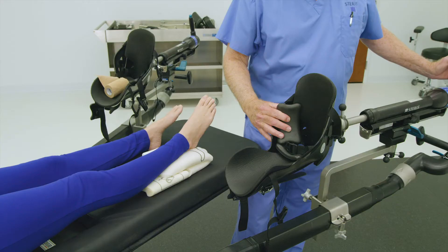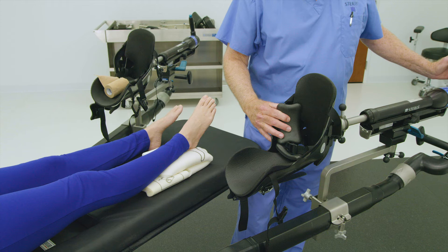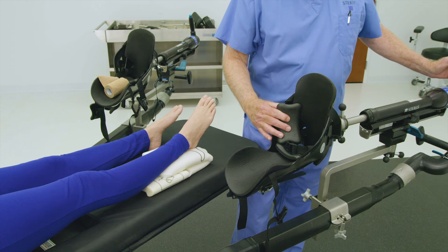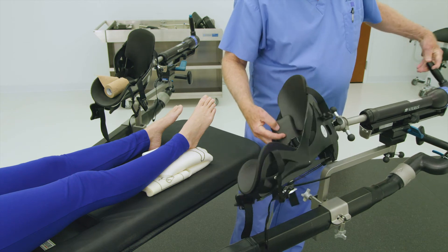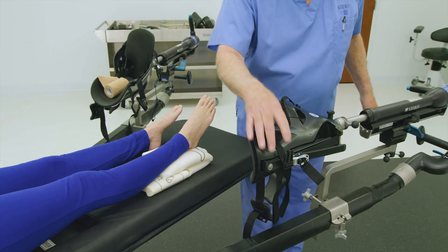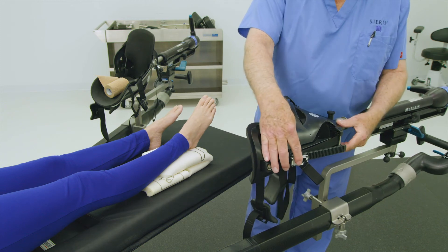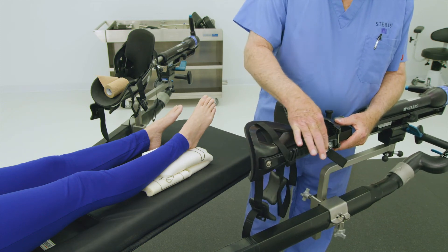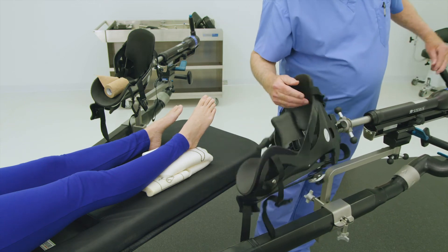Ensuring proper patient foot placement in the traction boot will secure the patient's foot when traction is needed. First, loosen the middle strap of the traction boot by releasing the strap ratchet found on the back of the boot. Release tension by lowering the ratchet assembly to the bottom of the boot.